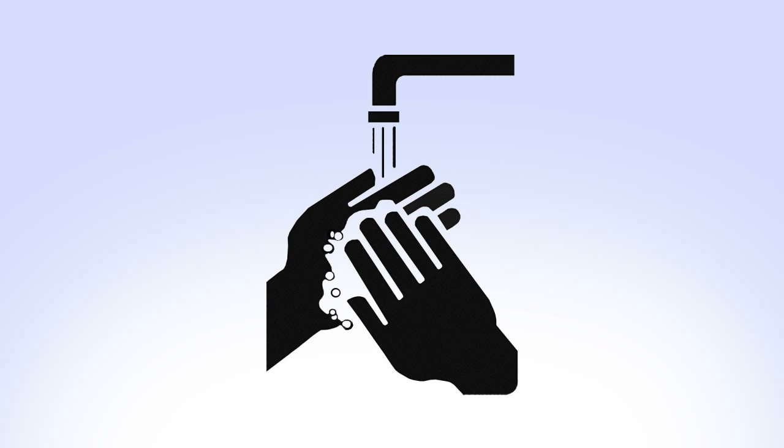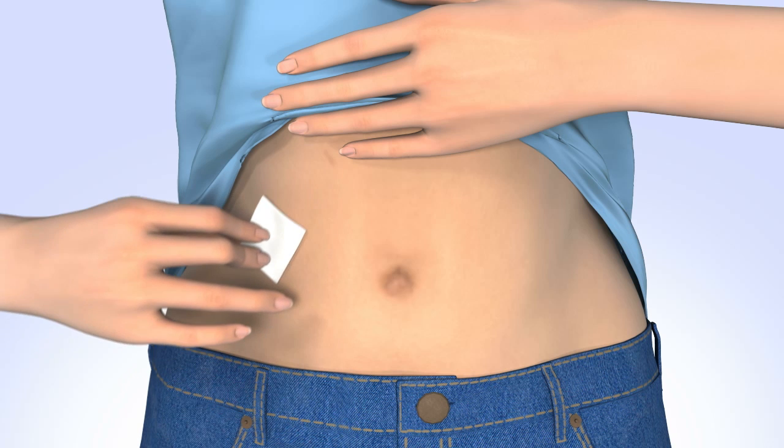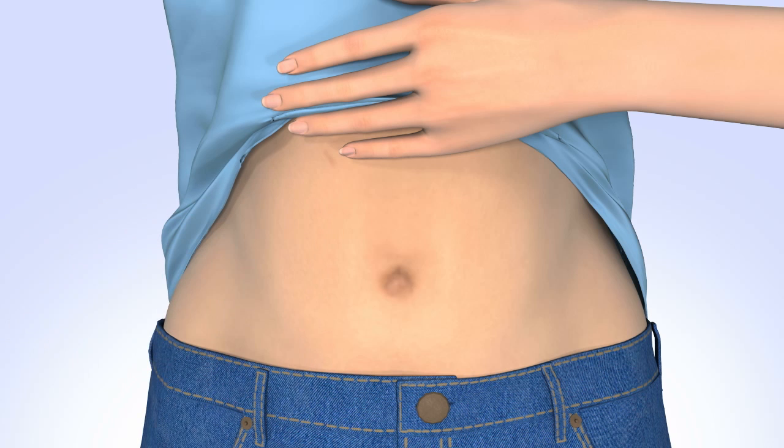Wash your hands before you begin. Clean the insertion site with alcohol and let the skin dry before inserting the sensor. Do not use any other product or tape on the site before inserting the sensor.